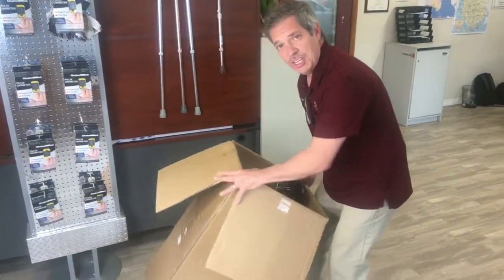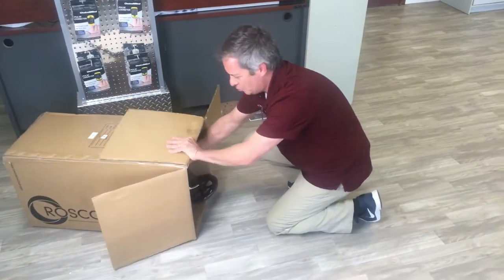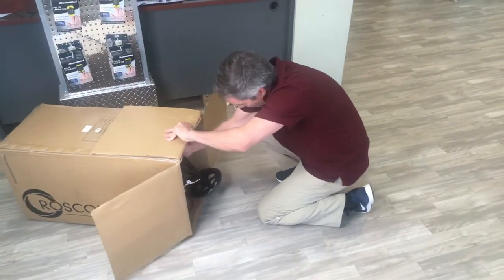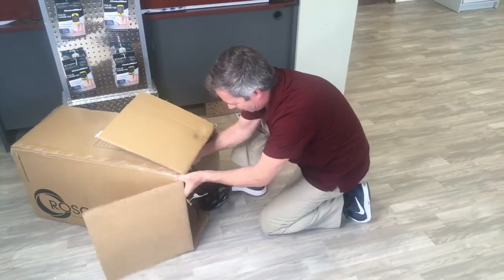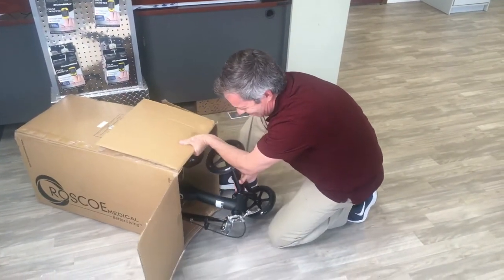Whenever you get your knee scooter, there is a little bit of assembly required, and it looks a little rough at first, but once you see what you've got, it's not too bad. So let me get this out of the box first.